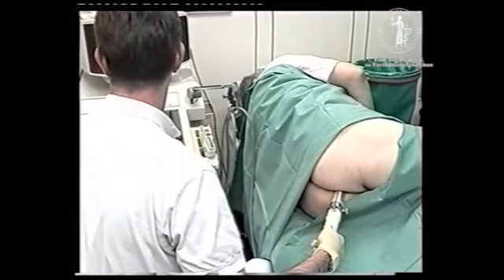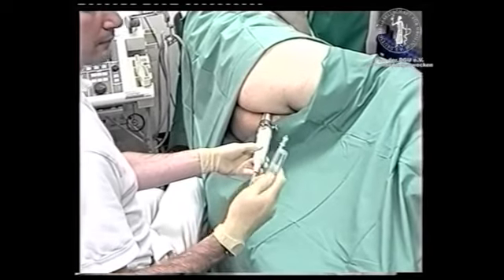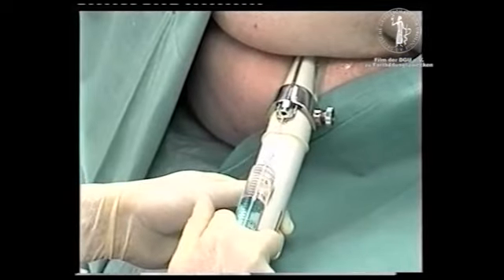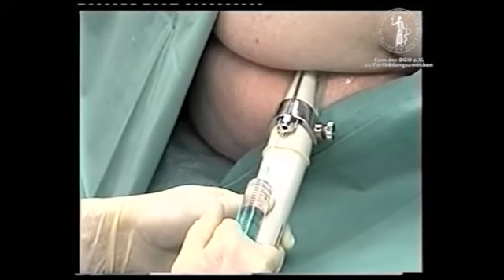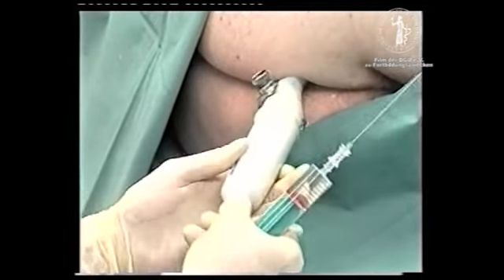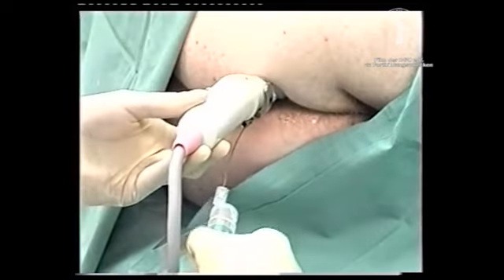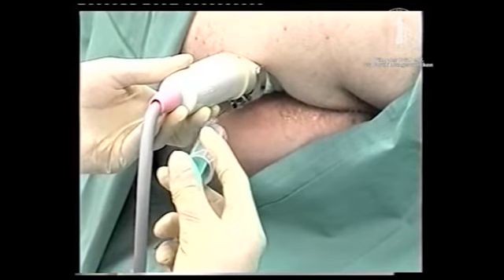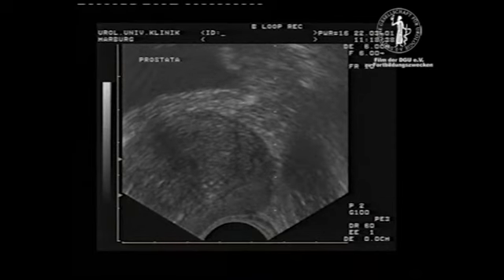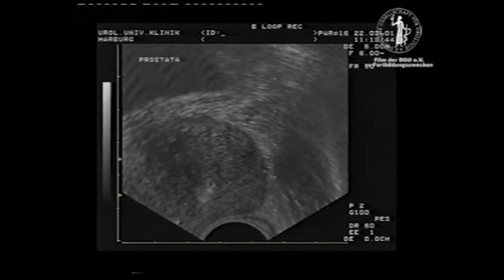Using a side-firing guidance, the patient is comfortably positioned on his left side. For performing the anesthesia, 10 milliliters of 1% Ultracain local anesthetic are injected posterior-laterally in the region of the neurovascular bundles on both sides of the prostate under TRUS control. For injection of the anesthetic, a 26-gauge fine needle is used. Under ultrasound control, the application of the anesthetic is directed to the posterior lateral aspect of the prostate on both sides. The exact position of the needle tip is easy to determine.